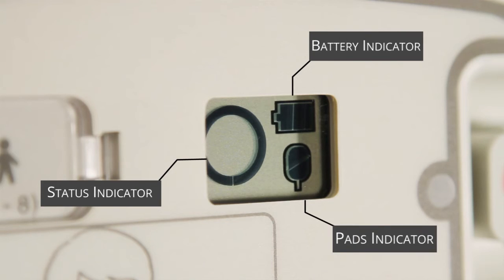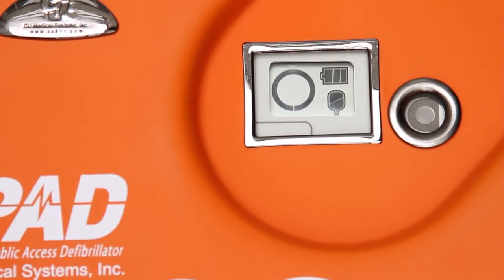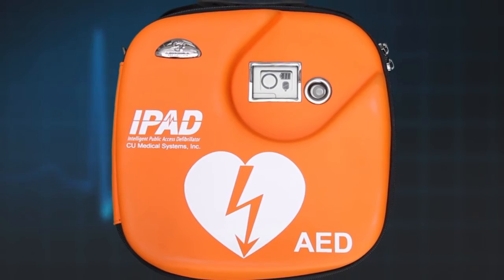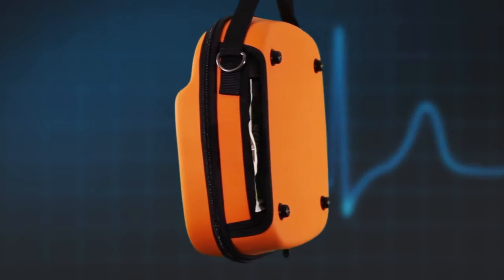How to fully check your AED will be discussed later in this film. The AED can now be placed inside the orange carry case. Gently pull the edge of the electrode pads through the slot in the side of the bag so that the pull tab is visible.